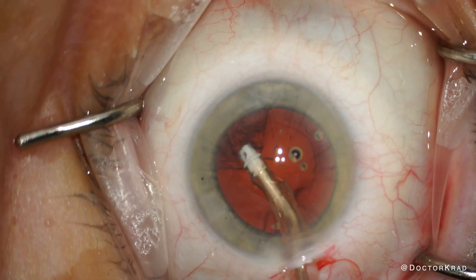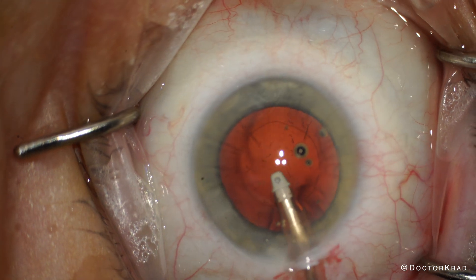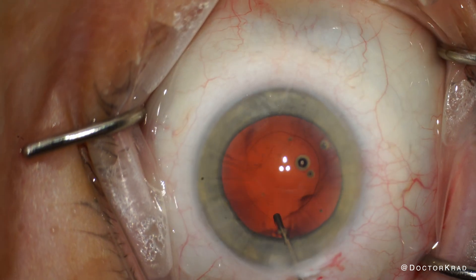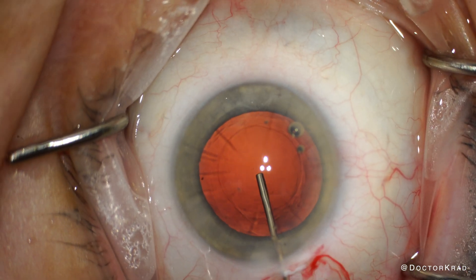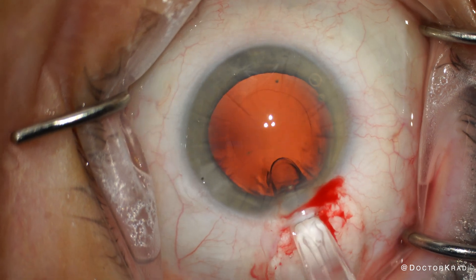After removing the cortex, polishing and flushing the posterior capsule to make sure it's as clean as possible, we expand the capsular bag with cohesive viscoelastic, and then insert the lens.